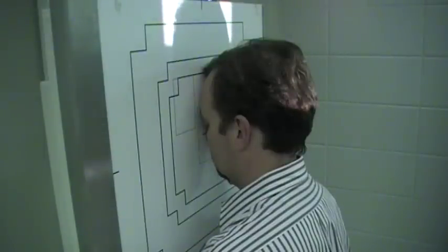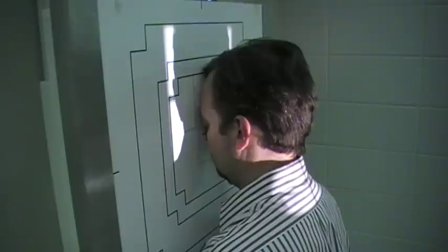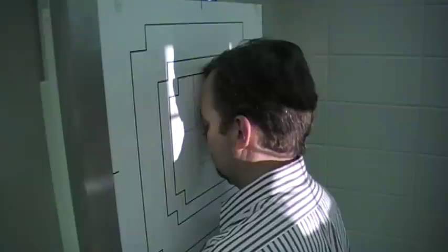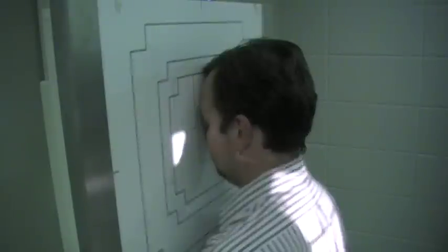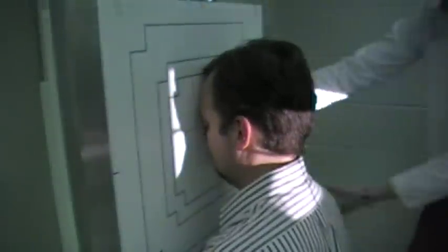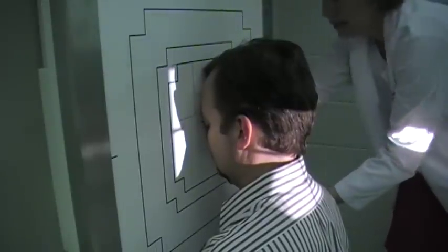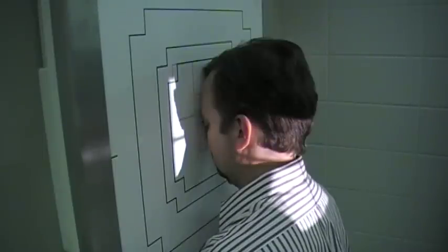So you want to get your 20 to 25 degrees, and you want to double check, make sure that it is exiting at the same level as the acanthion. And then just adjust your bucky. Okay, and I can go just a little bit lower. There you go.